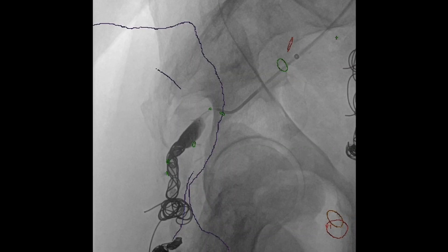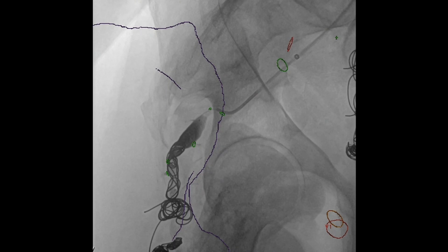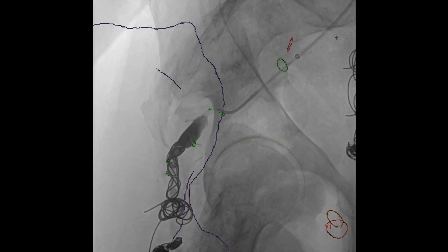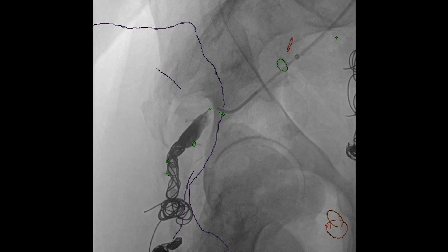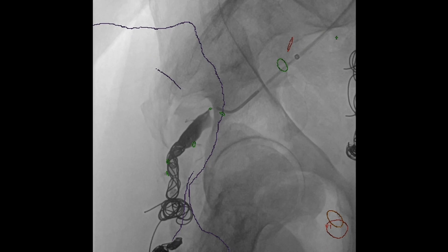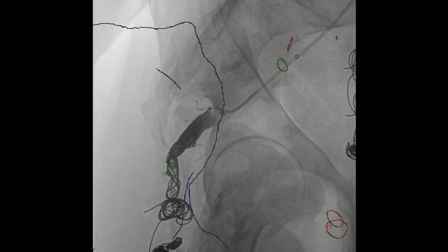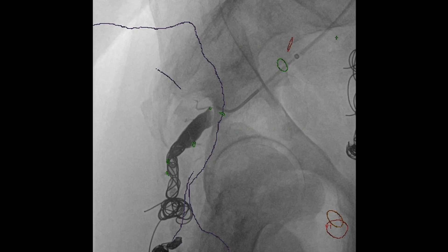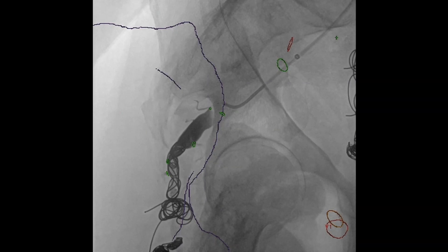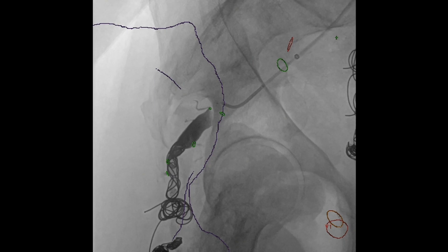Concerns are obviously non-target organ embolization — could we make the sciatic nerve ischemic? These things happen very rarely. These lesions are so vascular it's quite hard to render something completely devascularized. You can see the advantage of the onyx: it gets all these little secondary branches coming off the side of the main trunk.